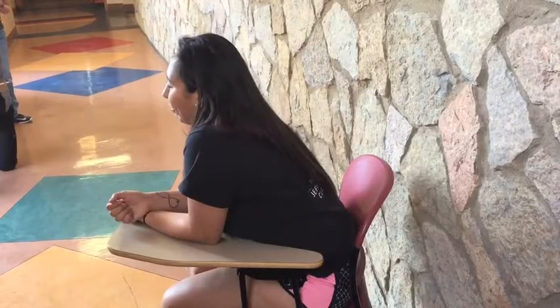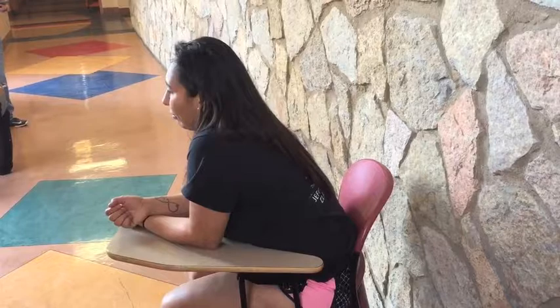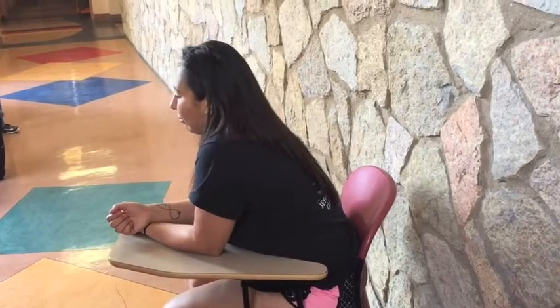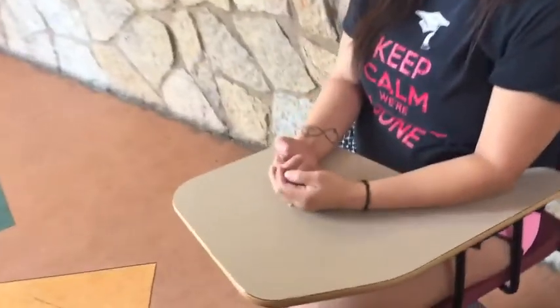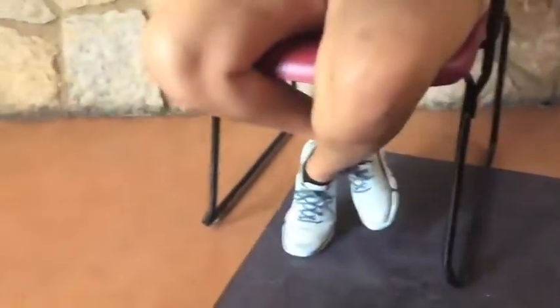The subject should have been sitting still for at least 5 minutes and refrain from smoking cigarettes or drinking caffeine at least 30 minutes before assessment. It is important to have your subject sit in a proper position to ensure accurate readings. Proper position should involve sitting straight against a backrest, palms facing up, and feet flat on the floor.